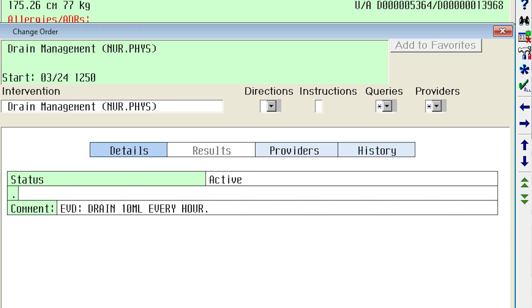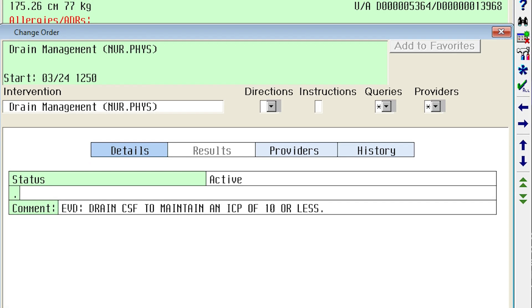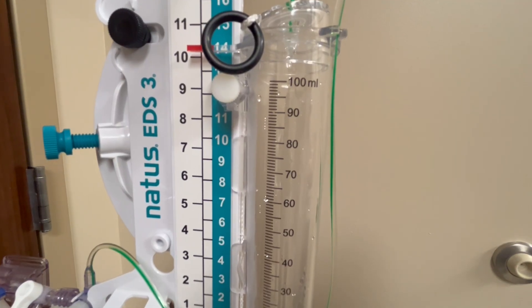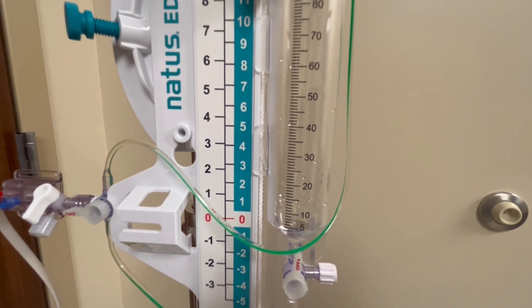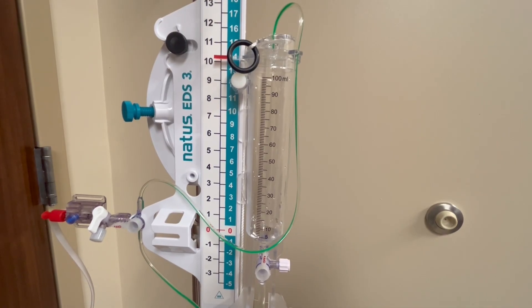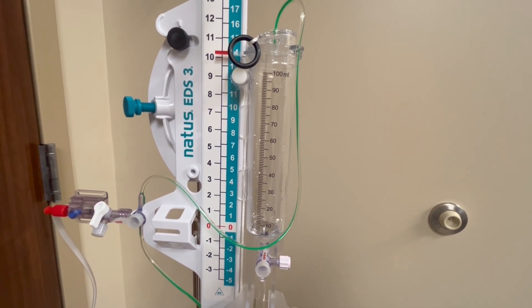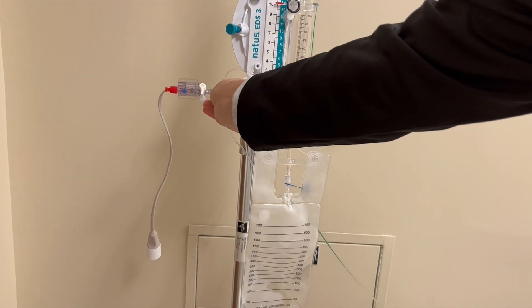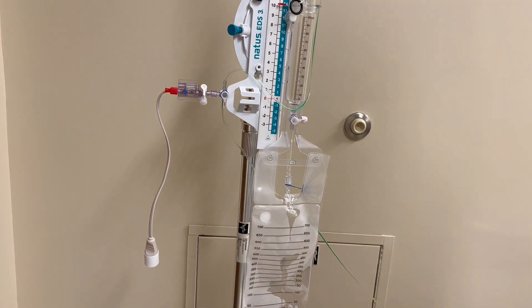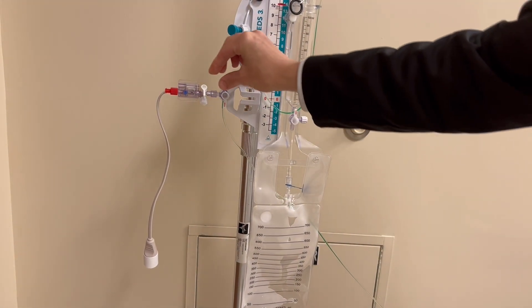The physician orders might denote how the provider wants CSF drained. Here are a few examples: drain 10 mLs every 1 hour, or drain CSF to maintain ICP of 10 or less. Once the clamps are open, if the patient's ICP is greater than what the EVD is set at, you will start to see cerebrospinal fluid drip into the drip chamber. Depending on the order, you can allow the fluid to collect, and then when it's time to empty — usually every hour — record the amount, turn the clamp off to the patient, open the drip chamber, allow the fluid to go into the drainage bag, then close both clamps and allow fluid to start collecting again.